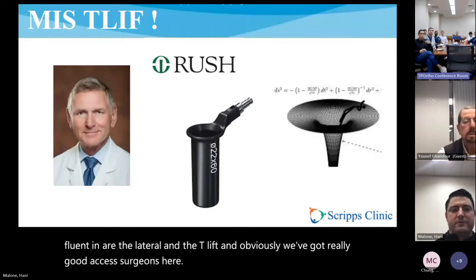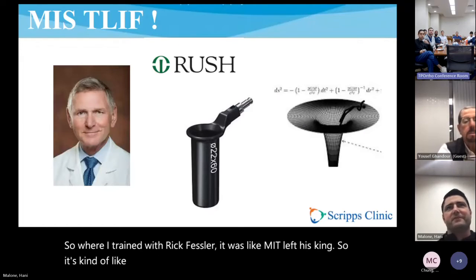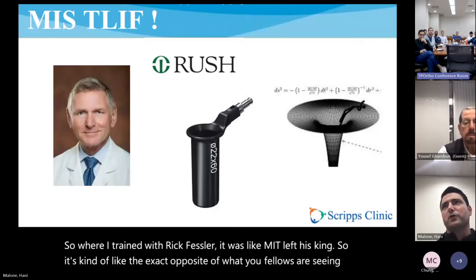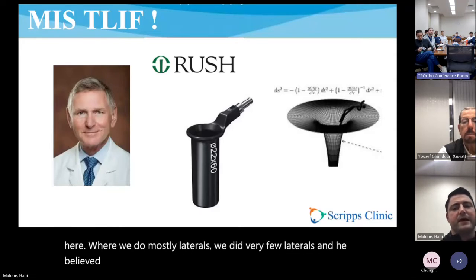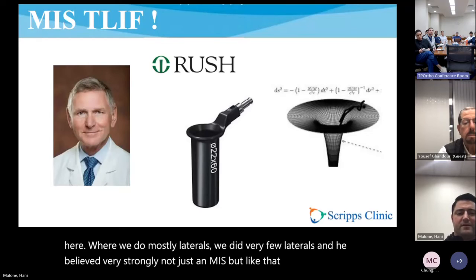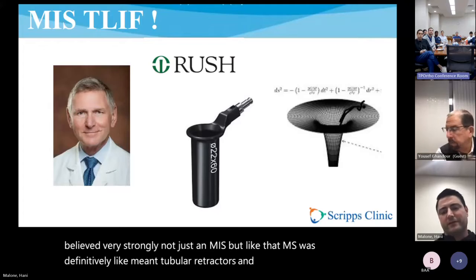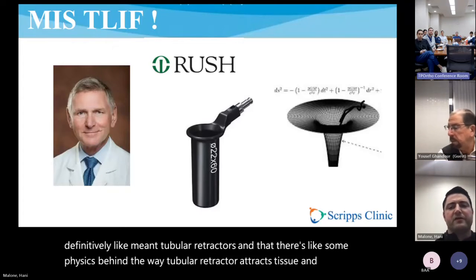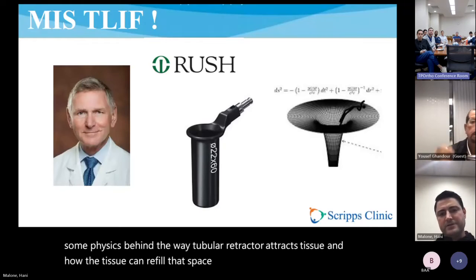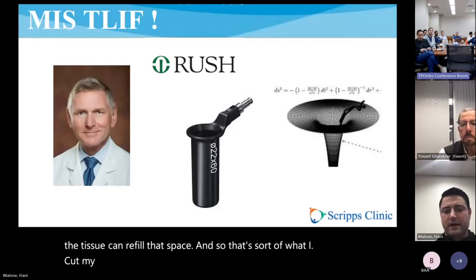So where I trained with Rick Fessler, it was like MIS TLIF is king. So it's kind of the exact opposite of what you fellows are seeing here, where we do mostly laterals. We did very few laterals. He believed very strongly, not just in MIS, but that MIS definitively meant tubular retractors, and that there's some physics behind the way a tubular retractor retracts tissue and how the tissue can refill that space. And so that's sort of what I cut my teeth on in Chicago.